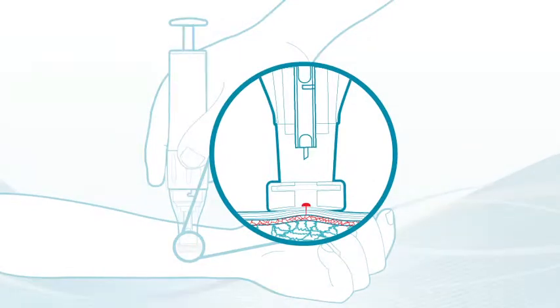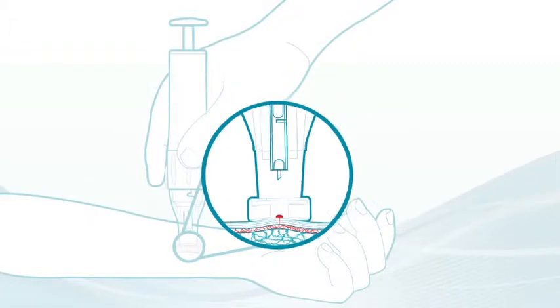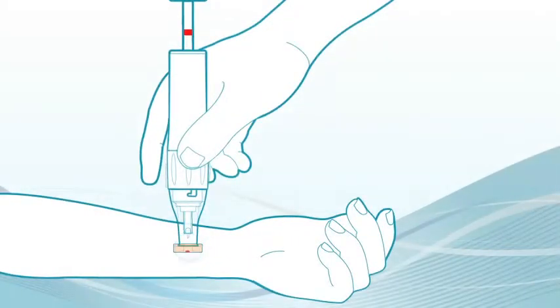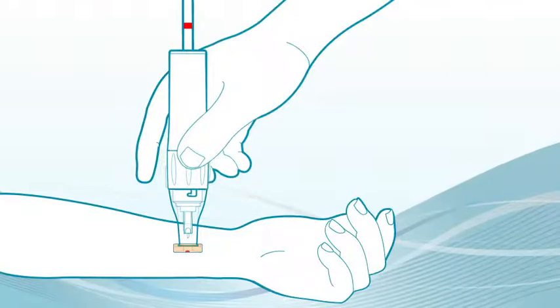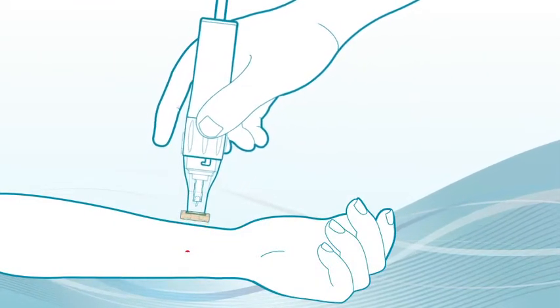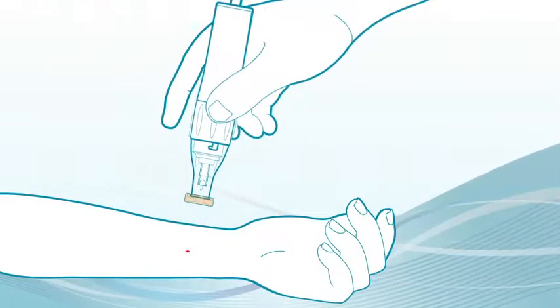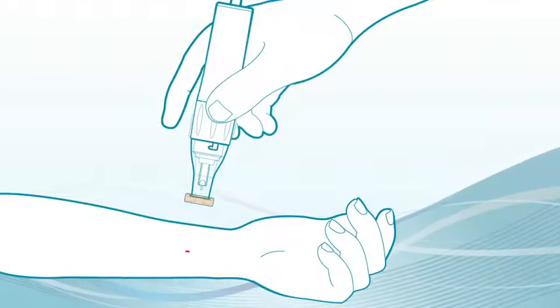Notice how Gentile's vacuum gently draws the skin up so blood flows more smoothly. It is soothing. There is absolutely no pain. Note how the nozzle contact tip assembly is so clear you can see when there's sufficient blood for your glucose meter to work. I now release my finger off the vacuum dissipation hole and then I remove Gentile from my body. The measuring of blood glucose is done in the conventional way.